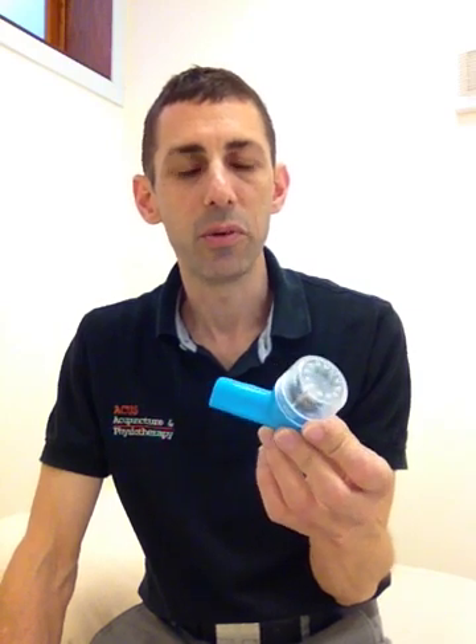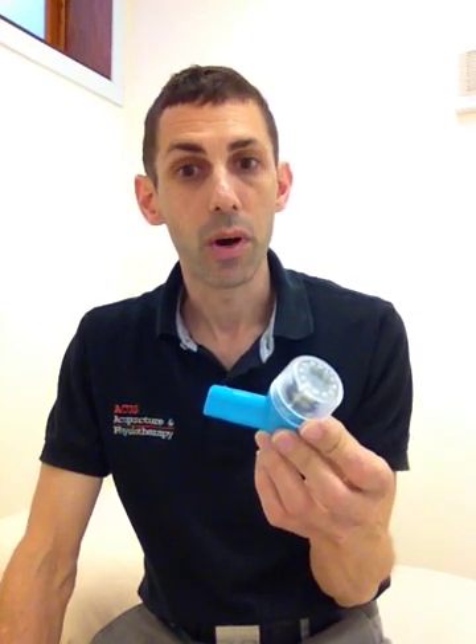You're quite interested. And you might remember that last time around we had a look at the flutter pipe or the PEP pipe, which produces that positive expiratory pressure. There are other ways of also producing the very same effect.